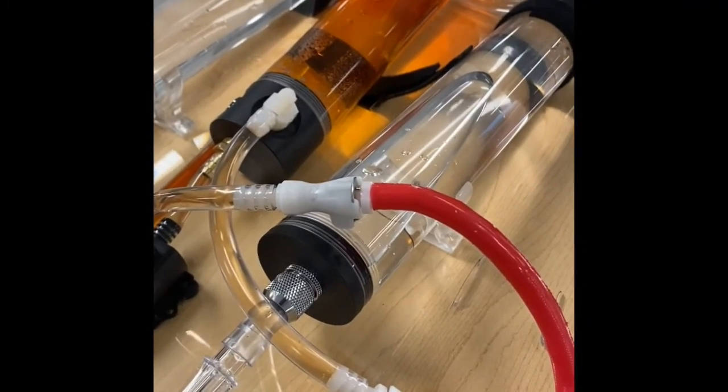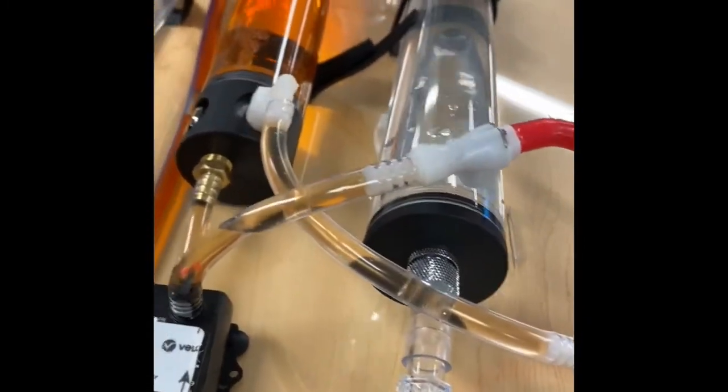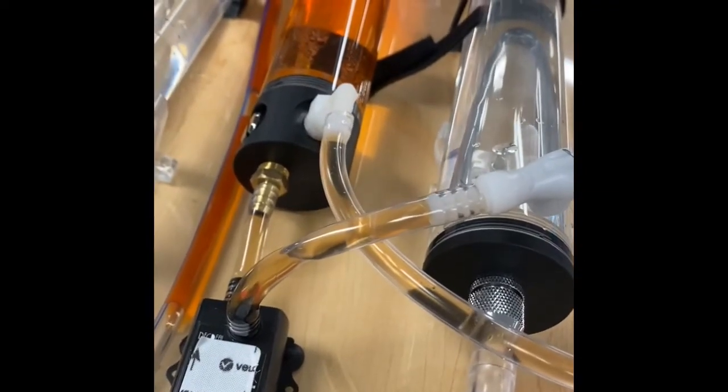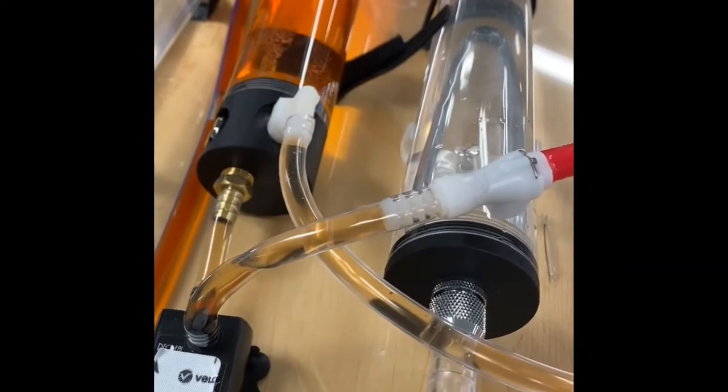Having three separate pumps, reservoirs, and circuits means you can cannulate any site without interfering with another, yet still connect cannulation lines coming from the ECMO pump as you would do normally.